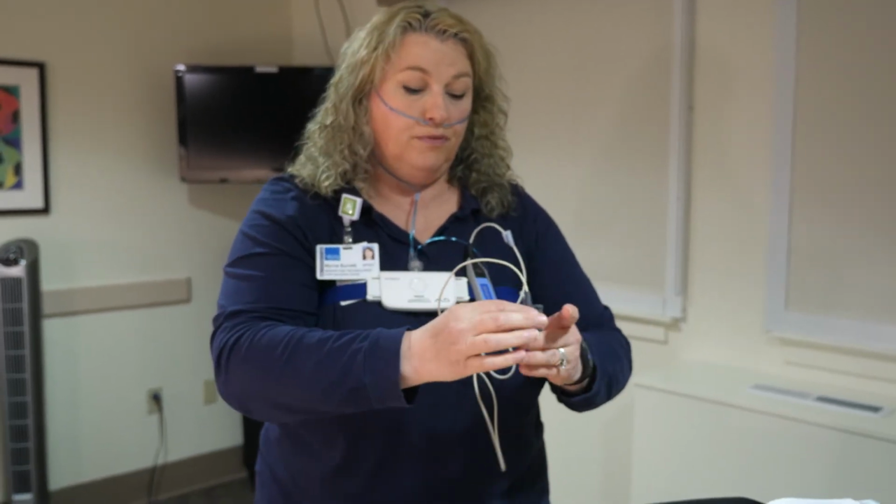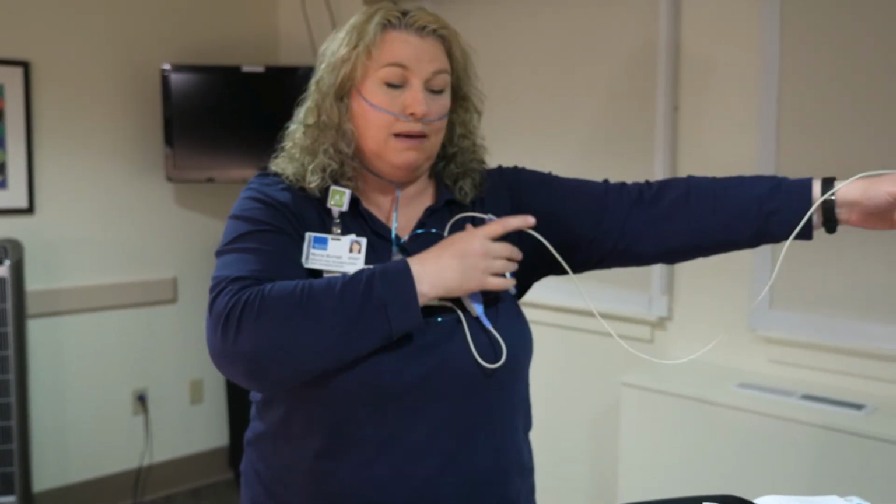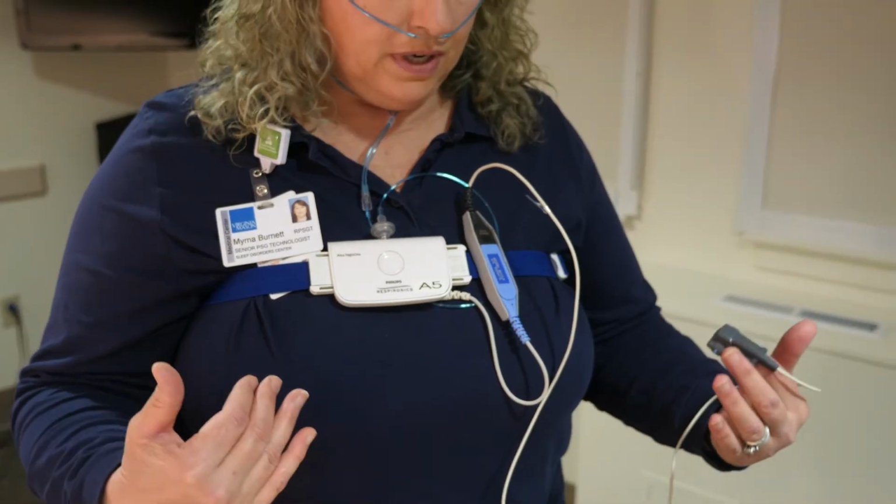Another helpful hint sometimes for patients, depending on the t-shirt or pajamas you're wearing, before you put the oximeter on your finger, you can even take this and slide it down the sleeve before you secure it on, just to kind of keep the cable out of your way. So once you've got the unit on, you're totally mobile. If you need to get up and go to the bathroom, get a drink of water, anything like that, try to just leave the device on and then go back to bed.